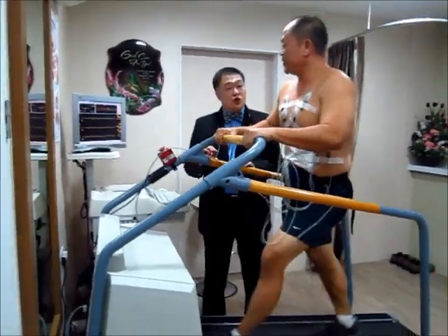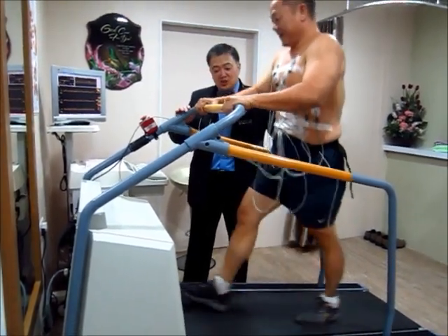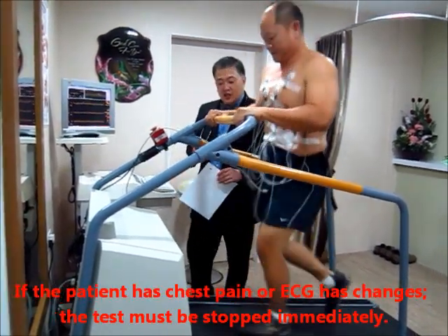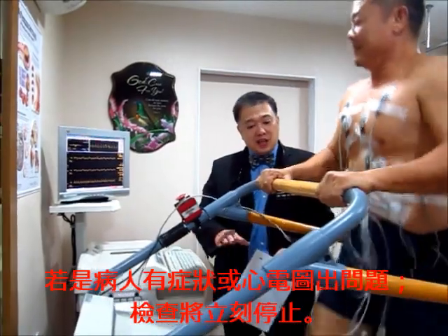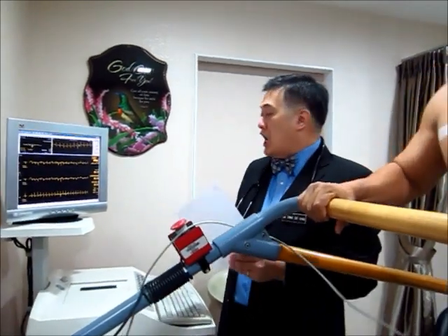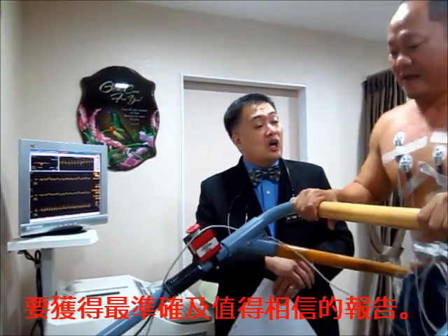Mr. Koh, in another 10 seconds you are going into stage 4 — it will be very steep and very fast. You can choose to walk very fast or run. So far the ECG is normal so it is safe to continue. I ask you to continue because as you spend longer time at more strenuous effort and the heart rate gets faster, the test becomes more accurate, and you can rely on the results to confirm that you indeed don't have blockage.